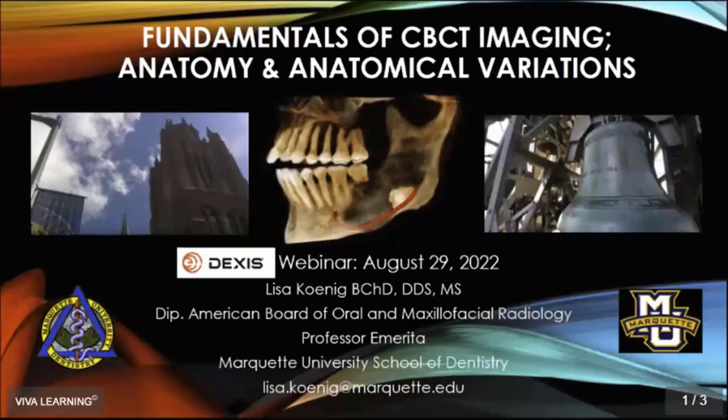as I said, sometimes if there are no issues, a periapical or even a panoramic radiograph will do. But oftentimes, if there's some concern about the position or the placement of the implant, really the only way to determine where that implant is, is to do another CBCT scan. And I know that at our institution, there was a reduced fee if this was post-operative.